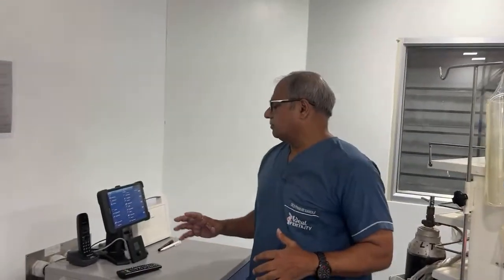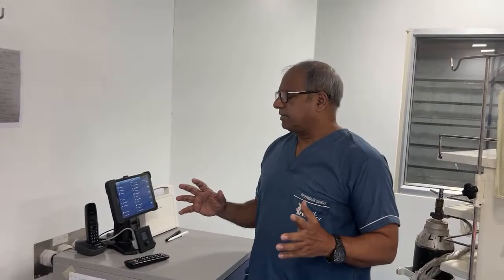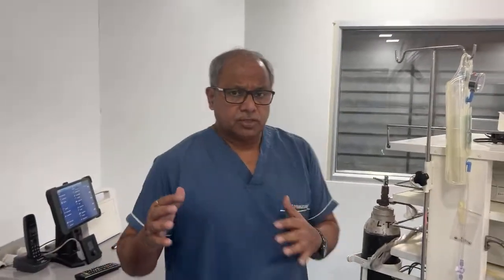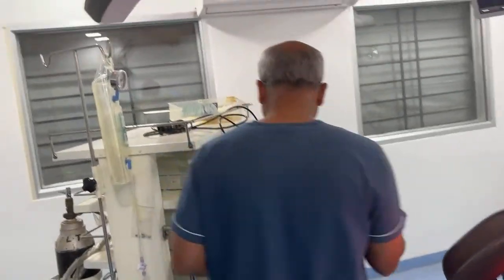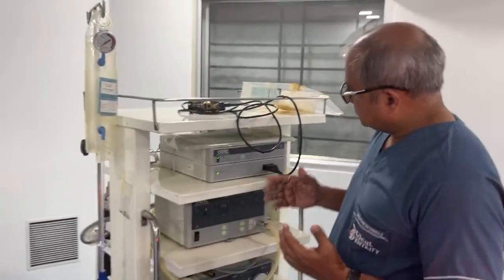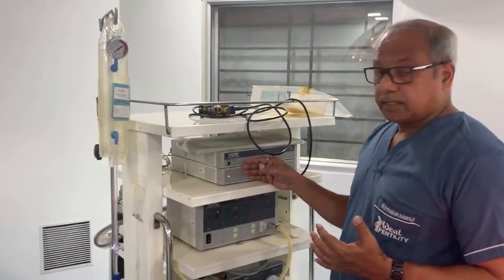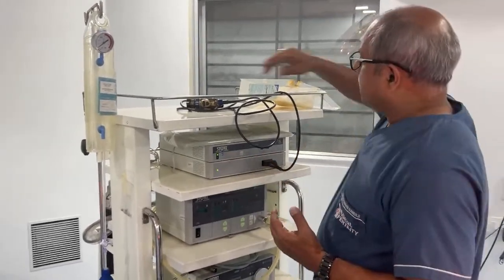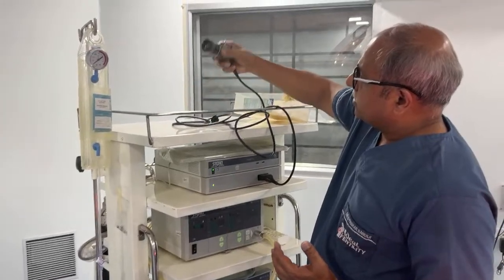So this OR1 system is one of the very finest ways of documenting and transmitting. This OR1 system is associated with a very high advanced level of what I have at present. It is an unending process. This is the image 1 camera system, and this is the camera which we use in our endoscopy.